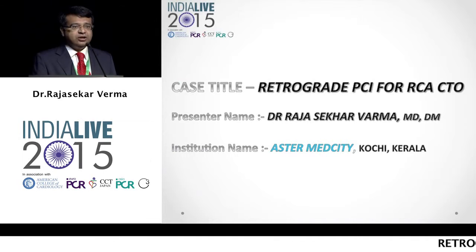It's my pleasure and an honor to be here today to present before you this retrograde PCI for a patient with a CTO of the right coronary artery.